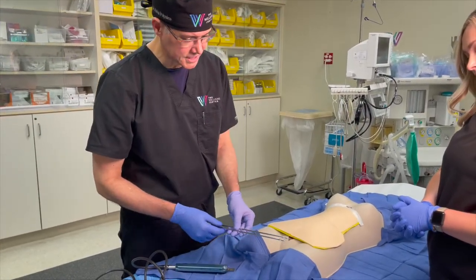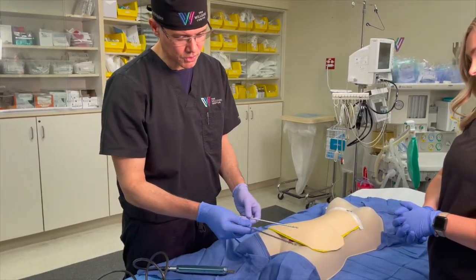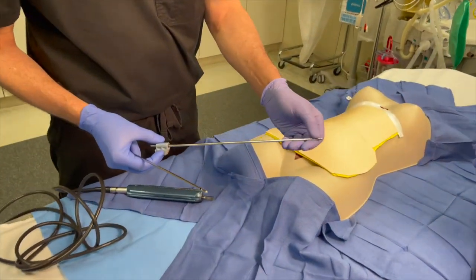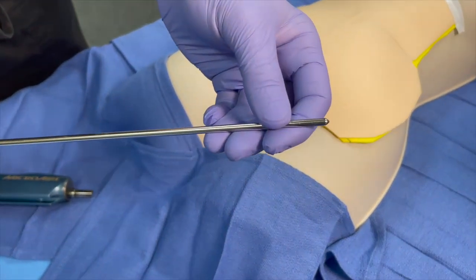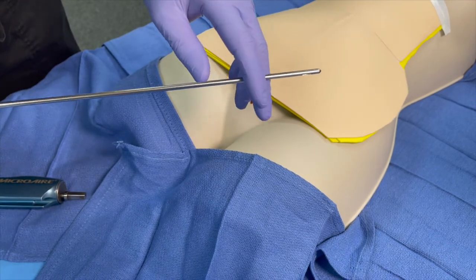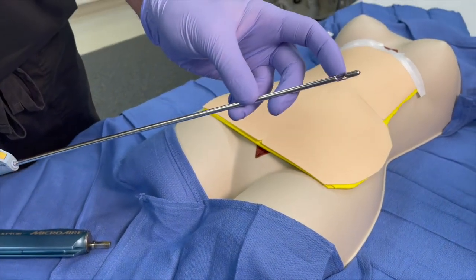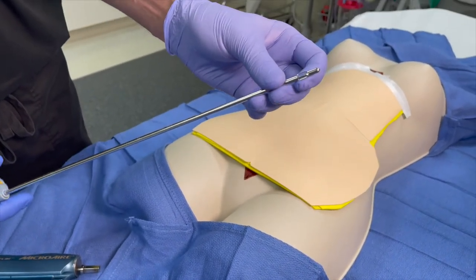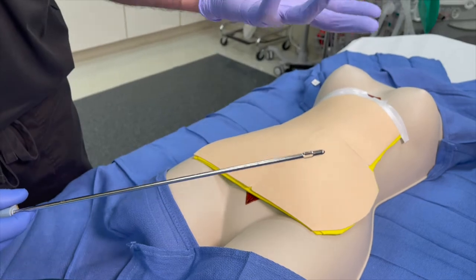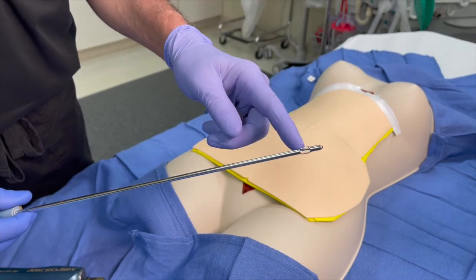Now we're going to show you the different types of cannulas and the things that we use for liposuction. There are a lot of different cannulas or tubes. I typically use one that has the holes on one side — that's my main one for sculpting, because you know where the holes are and can direct the suction where you want it. There's another one that's a little more aggressive with a basket tip or flared tip, which we use for more etching or sculpting, or for areas where the fat is a little more firm from previous liposuction.